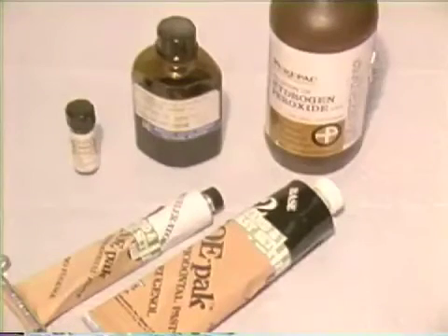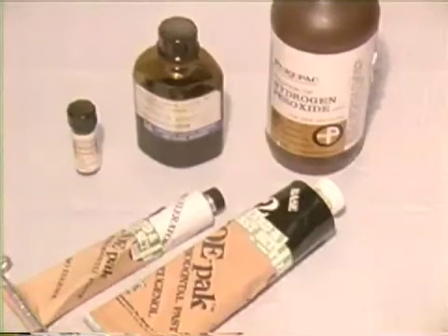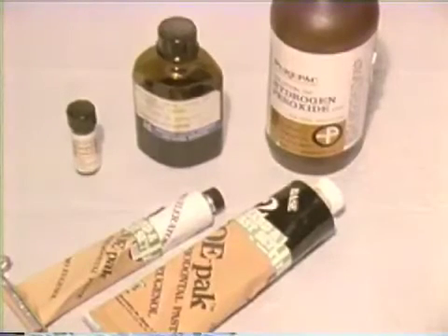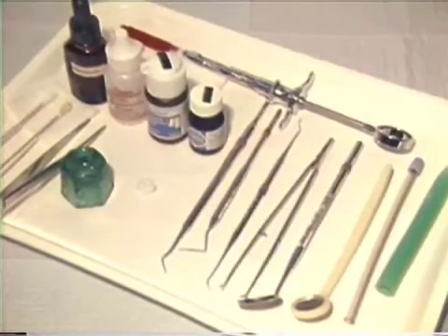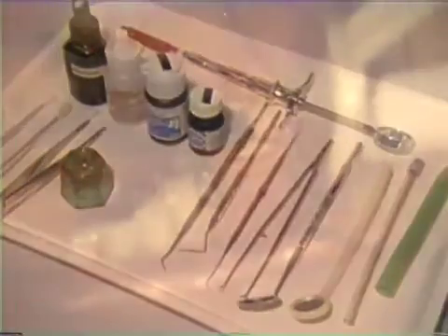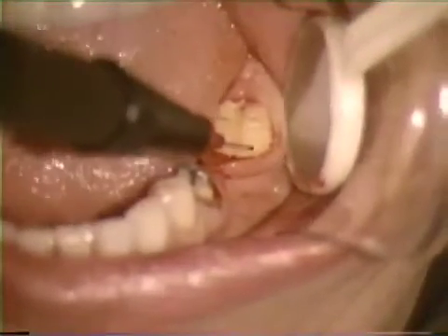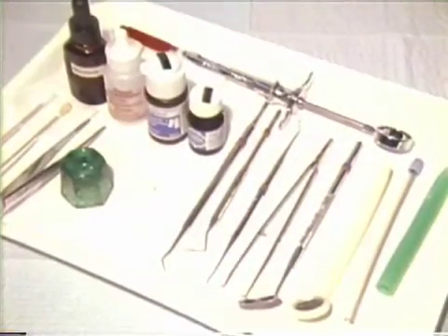Medicaments useful during and following electrosurgery are tincture of myrrh and benzoin for its astringent effect, hydrogen peroxide for cleansing, and periodontal dressing for packing tissues following extensive gingivectomy procedures. Tray setups must include a plastic mouth mirror, a plastic high-volume evacuator tip, and a plastic saliva ejector. Metal instruments must not touch the activated electrode tip, since grounding with the activated electrode can result in a serious burn or other undesirable trauma.